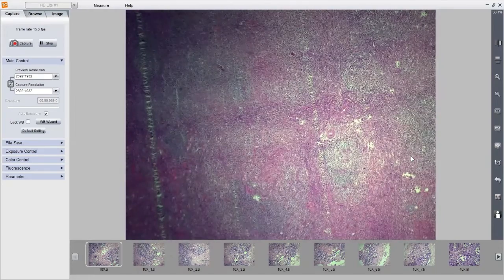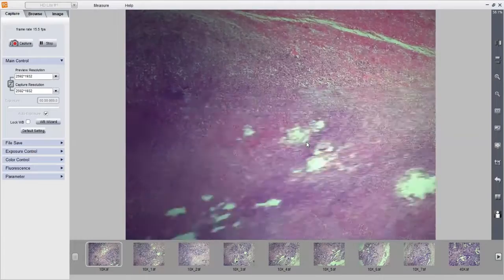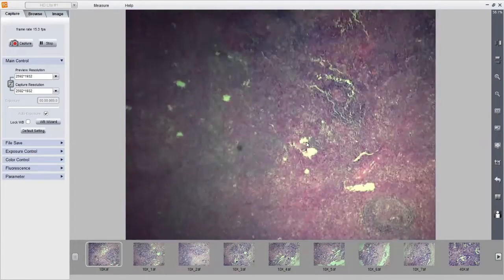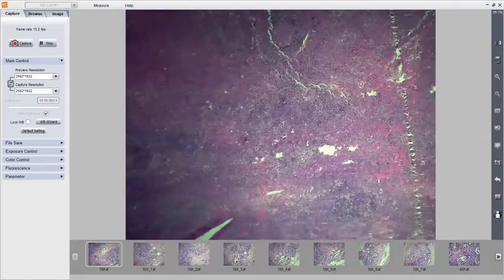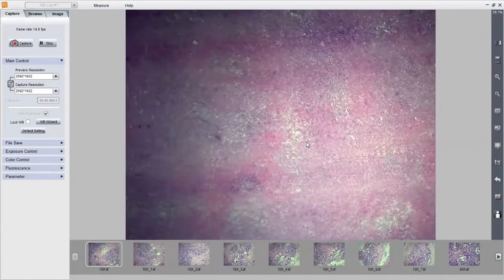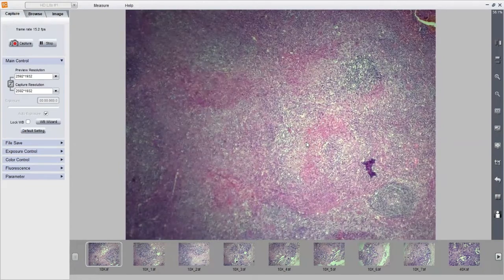Here we are seeing a very pink node, right? Pink. Why is this node pink? Can anyone tell why the node appears very pink here? Because of what cell? Histiocytes. Yeah. Because of a lot of histiocytes, the node has started appearing very pink.